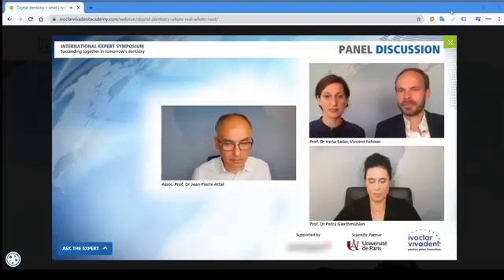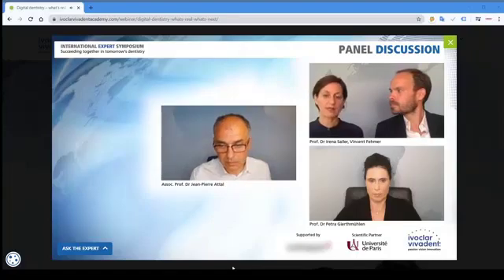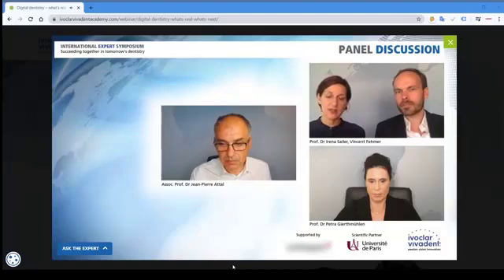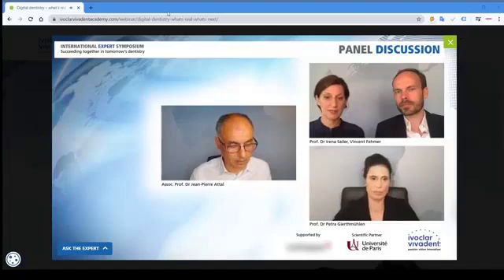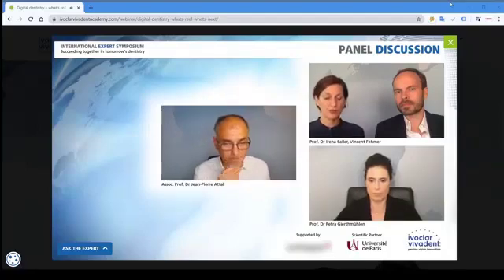to the lithium disilicate. And we have published a study, and it will appear in a very recent issue of the International Journal of Prosthodontics, specifically on the aesthetic, but also on the cementation outcomes of lithium disilicate crowns to Ti-base. And we found that a bis-GMA resin with an opaque color, like a Multilink or a Panavia cement with an opaque color, will really deliver the best outcomes.